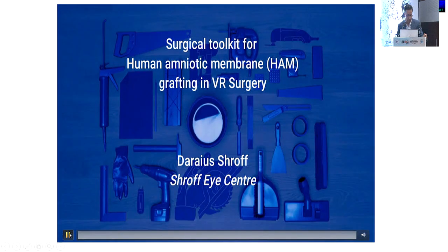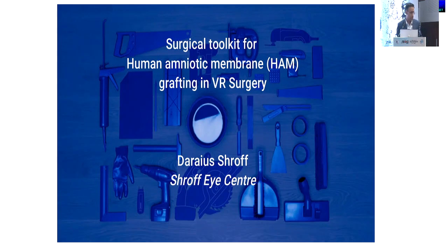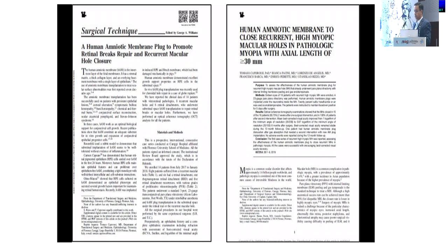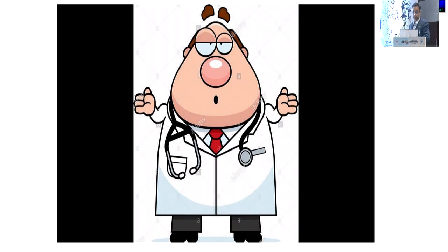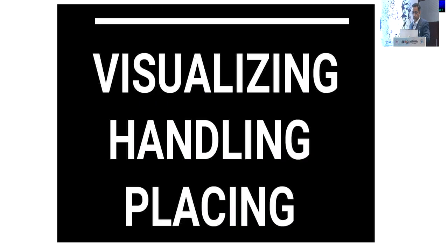Surgical toolkit for HAM grafting in VR surgery. Dr. Rizzo's group recently described the brilliant concept of human amniotic membrane or HAM grafting for recurrent macular holes. However, there's hesitancy in adopting this technique due to difficulty in visualizing, handling, and placing the graft.